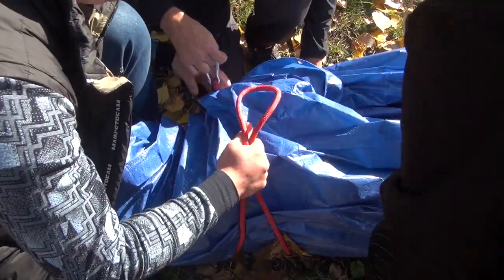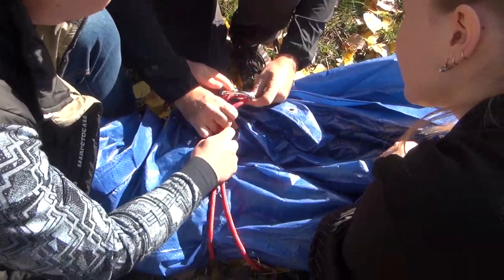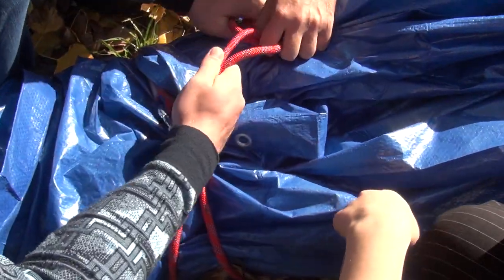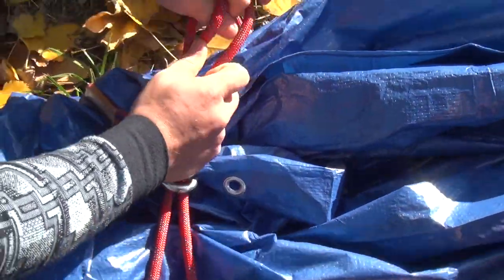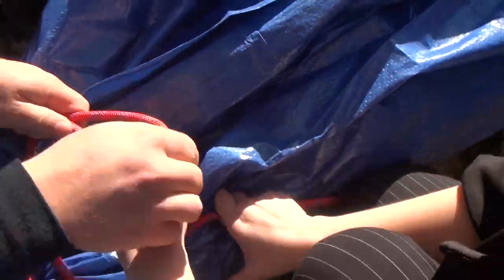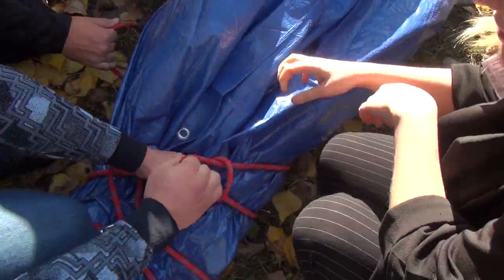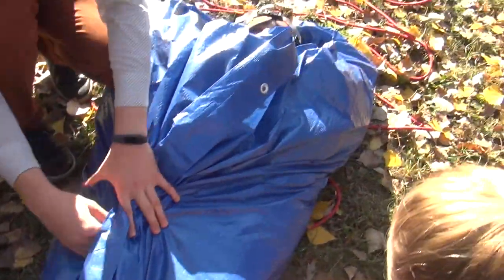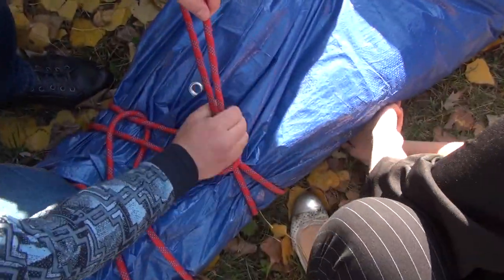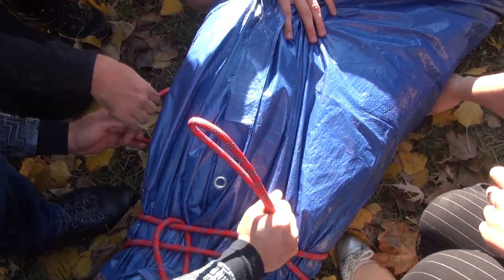So getting this one through and put it... No. Like this. Through. Like this. And this is the next loop. And you put this one through. Yes. And then that one. Now be careful that you don't put it all the way. Yeah? Yeah? Okay. And if you feed it through, because sometimes you have to feed it through a little bit, make sure that you don't pull the whole loop out. So if you have too little, yeah, okay, just go through.